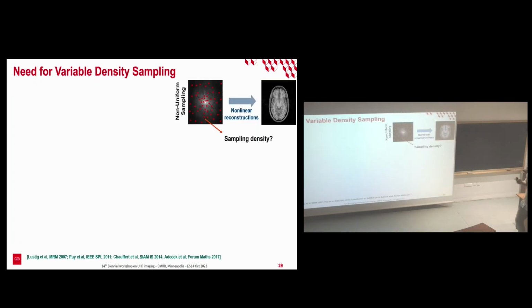Anyway, the second ingredient is what we called incoherent sampling. Here I won't go into details to save time, but imagine you have your sinusoidal case, just a sinusoid, which is represented as just a frequency peak in the frequency space.